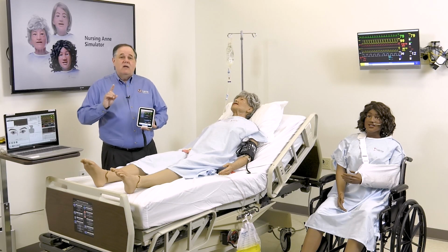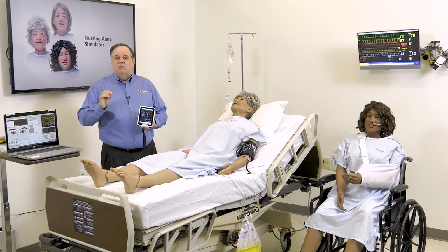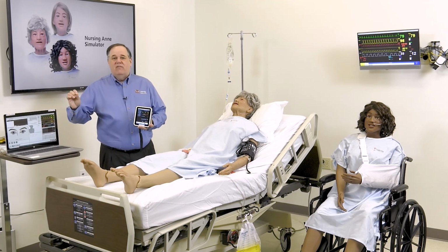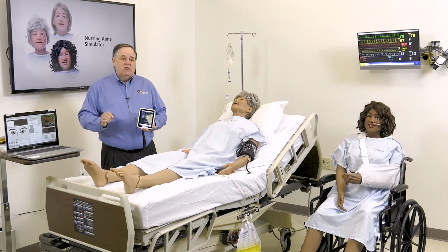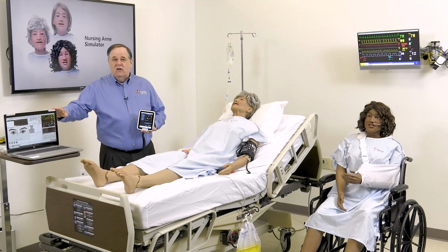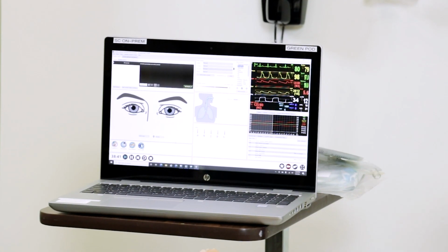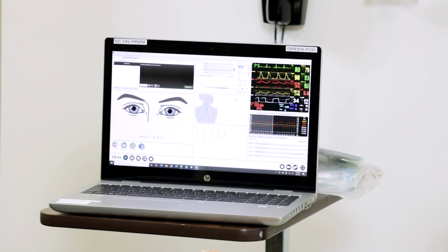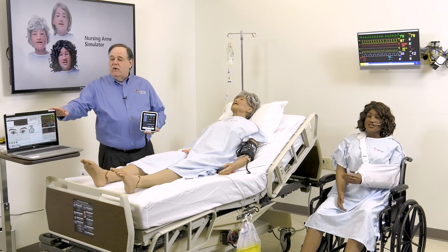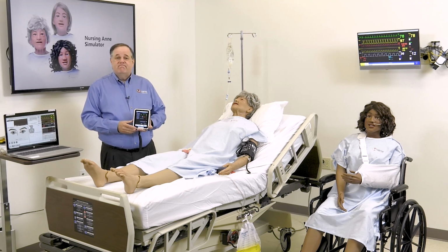There is one exception: if you want to use your Nursing Simulator with a ventilator. You will have to buy an optional piece of equipment called the ASL 5000, which is great for ventilator training and works very well with Nursing Simulator. You will require the Leap PC to operate that particular feature. Otherwise, its normal clinical functions can be operated either by the SimPad or by the Leap software, and you just pick which is best suited for your environment.